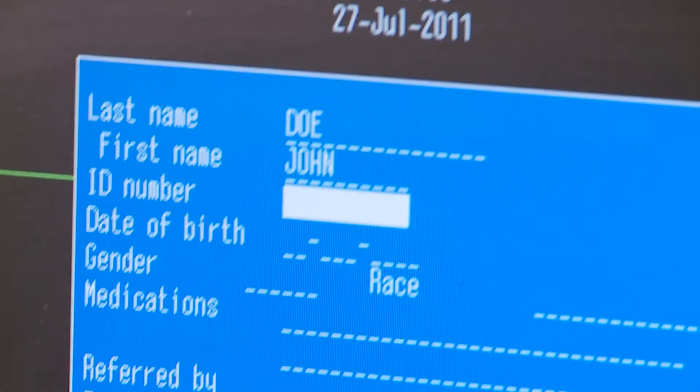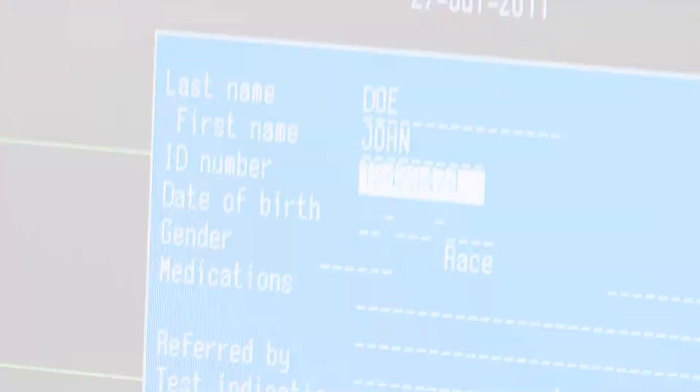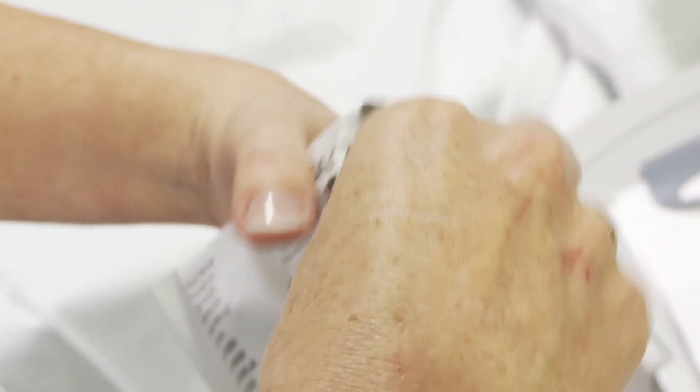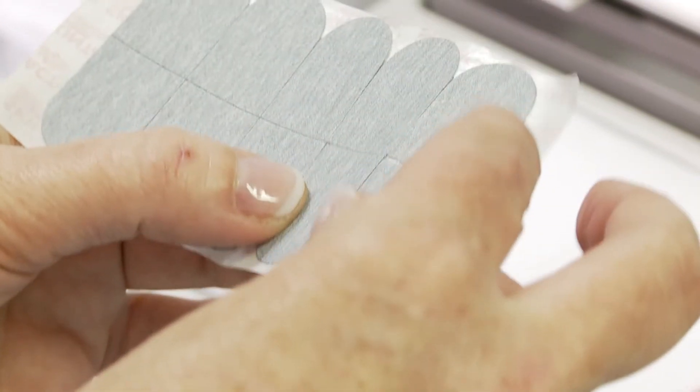If the ECG machine does not allow you to enter the patient details into it, then you must write the patient's details on the trace when it's printed. Remove the disposable electrode tabs from their packet and place them on the ECG trolley along with an abrasive preparation pad, the alcohol-based cleansing wipe and a razor if required.